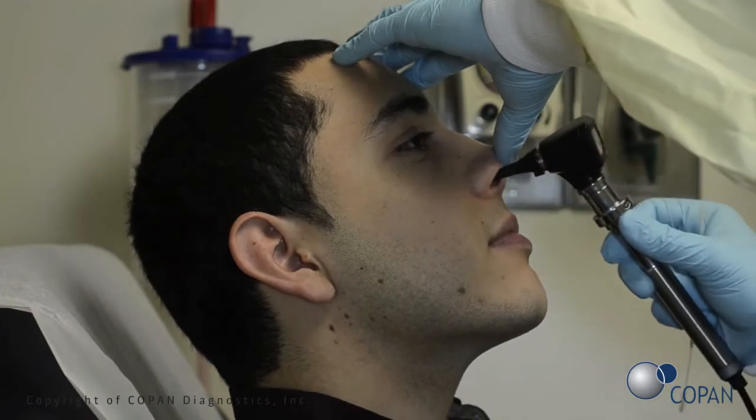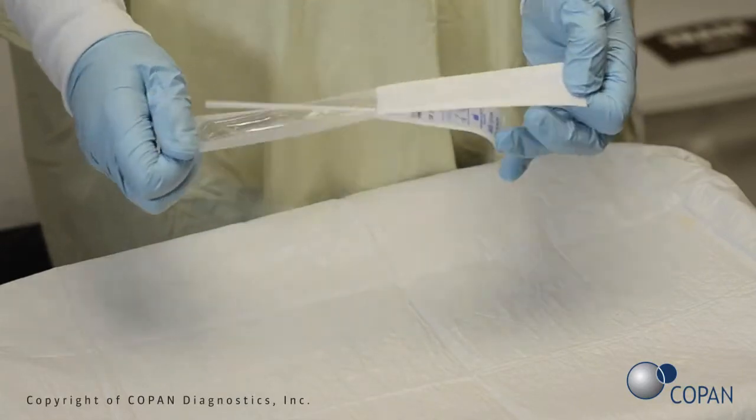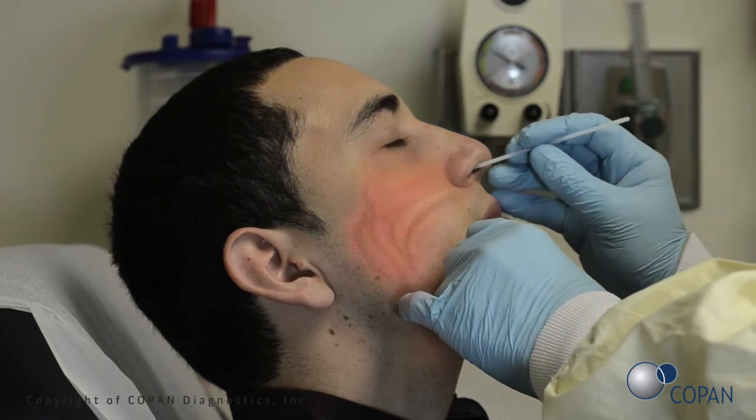Check for nasal obstructions. Open swab package. Gently insert the swab into the nostril, keeping the swab near the septum floor of the nose while gently pushing the swab into the post-nasopharynx.